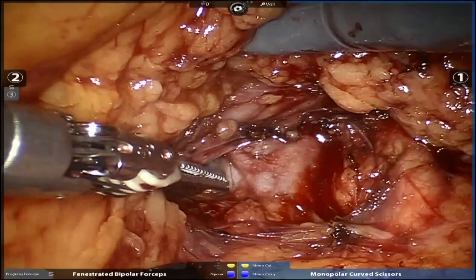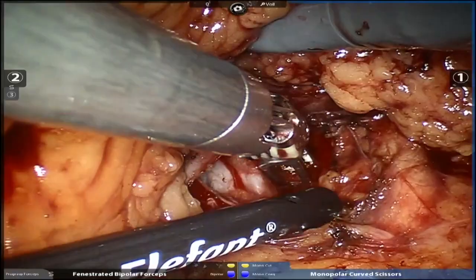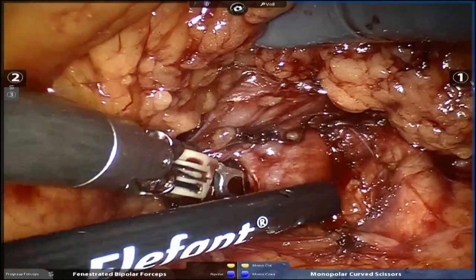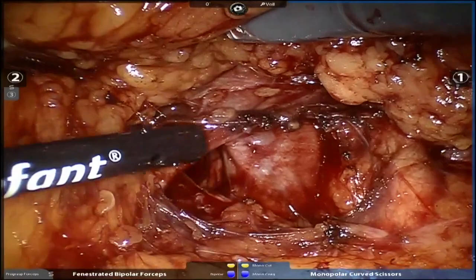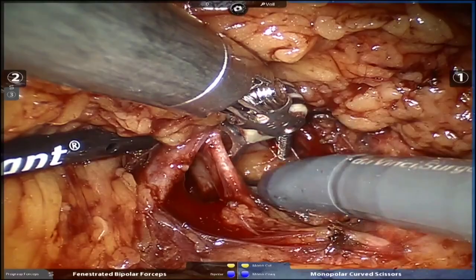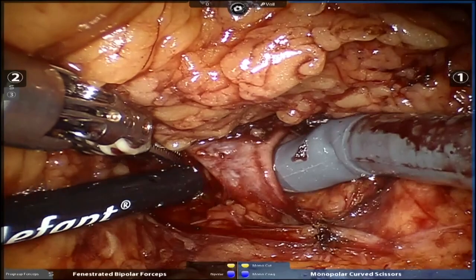But you look very carefully on your CT scan for the vessels, so you absolutely really know the situation. Absolutely. Irregardless of the reconstruction, I'm going to be looking for all the vessels. Suck in here, Brando, right there. Right here, just hold back, Brando, best you can. Right here, thank you. Suck, best you can. Yep.